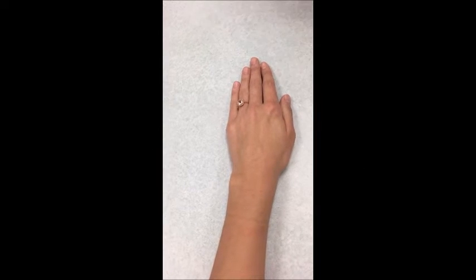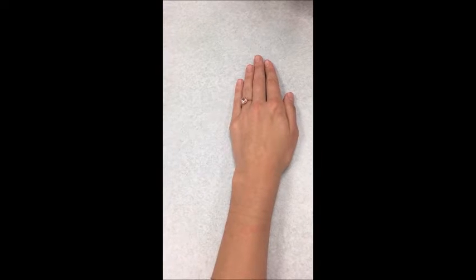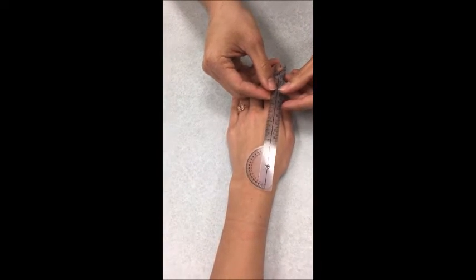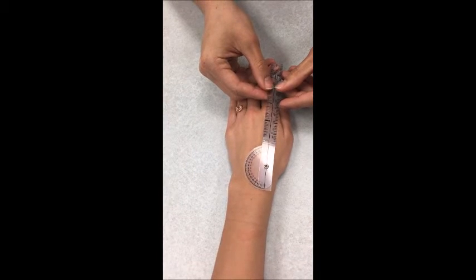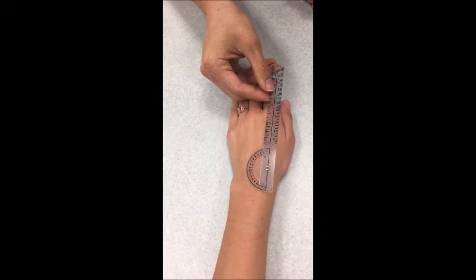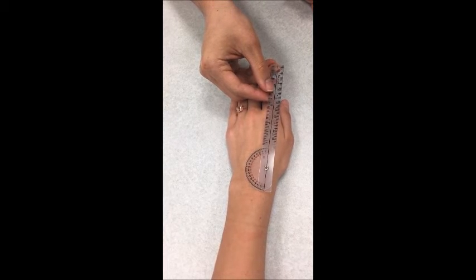The client is positioned the same as described in the first method. The axis is over the CMC joint at the base of the thumb metacarpal. The stationary and movable bars are together over the second metacarpal and parallel to the radius. The therapist will ask the patient to extend the thumb.